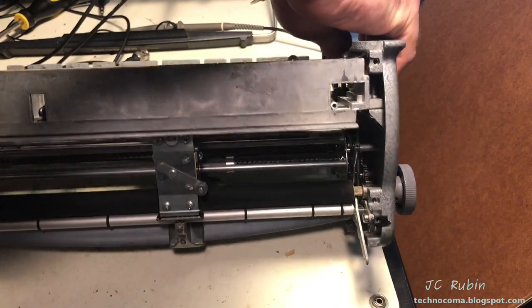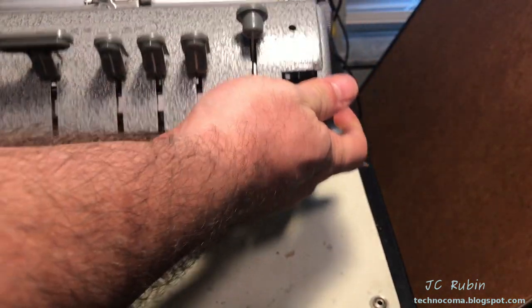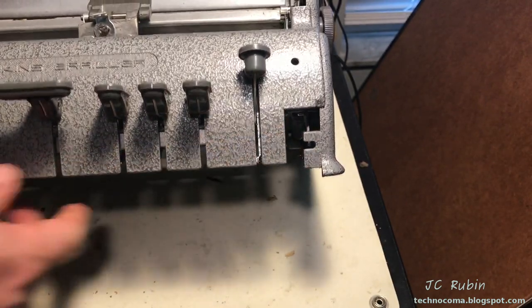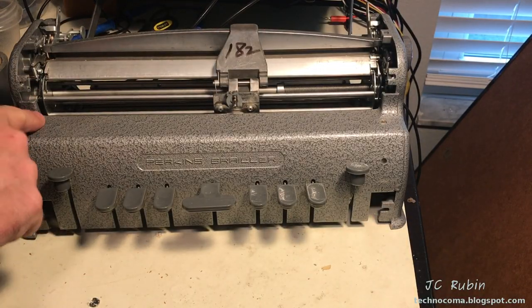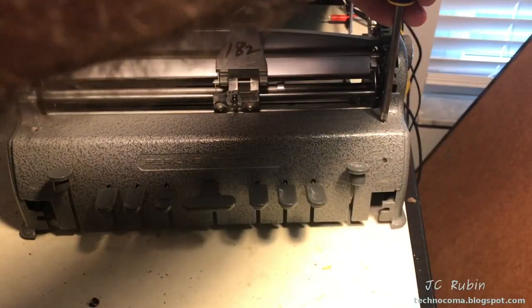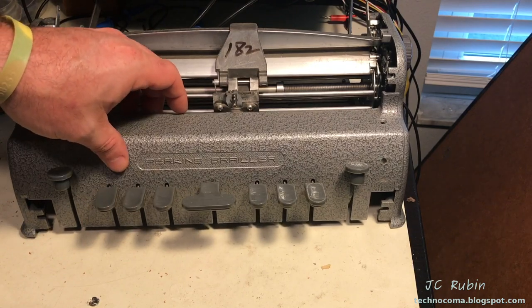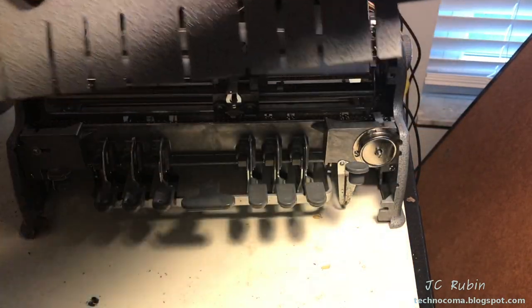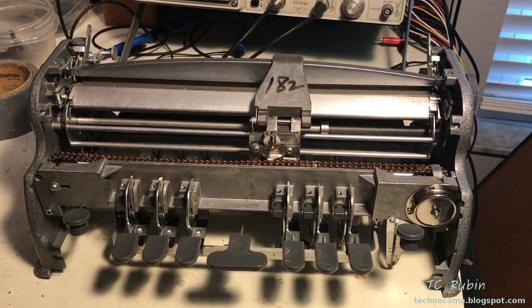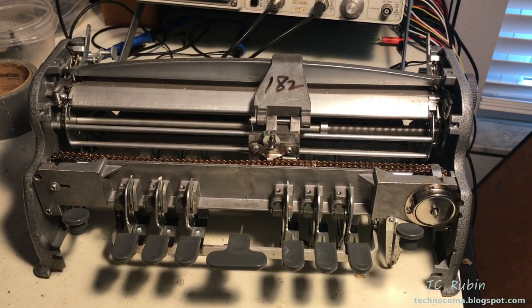Turning the unit back over with the apron removed, I'll remove the two front plate attaching screws and lift off the front plate. This is considered the full disassembly of the unit for cleaning and maintenance. All screws from the different sections are grouped and categorized in bowls.